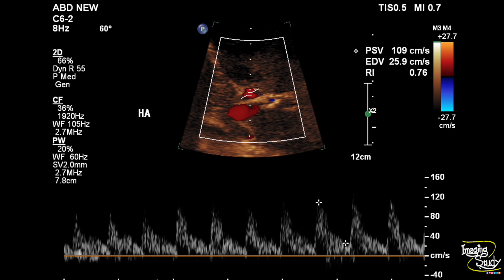If you look at the hepatic artery in comparison to the portal vein, it has a good amount of flow — about 109 centimeters per second — with a resistive index of 0.76. This indicates that the portal vein is now giving less blood and the hepatic artery is in compensatory action. Unfortunately, after this scan, the patient survived for only one and a half months.